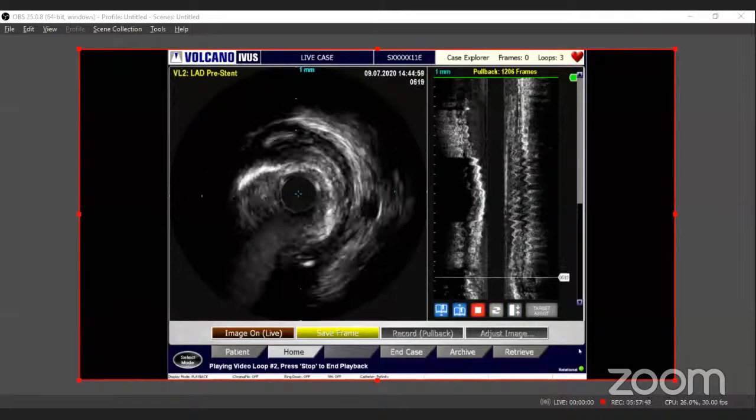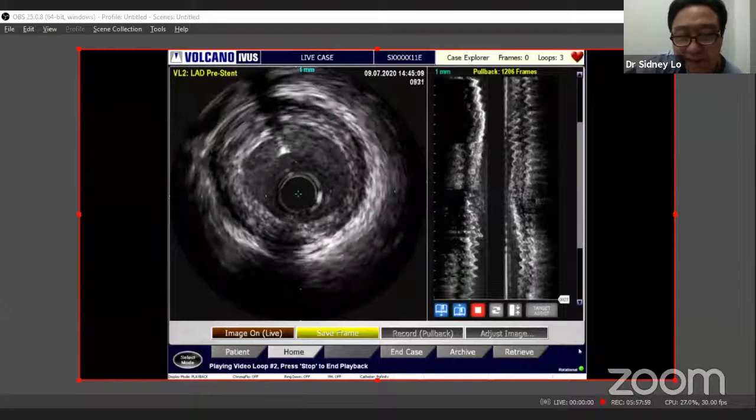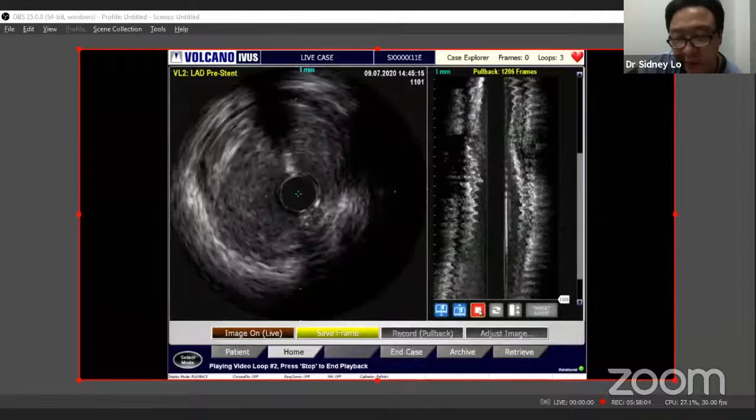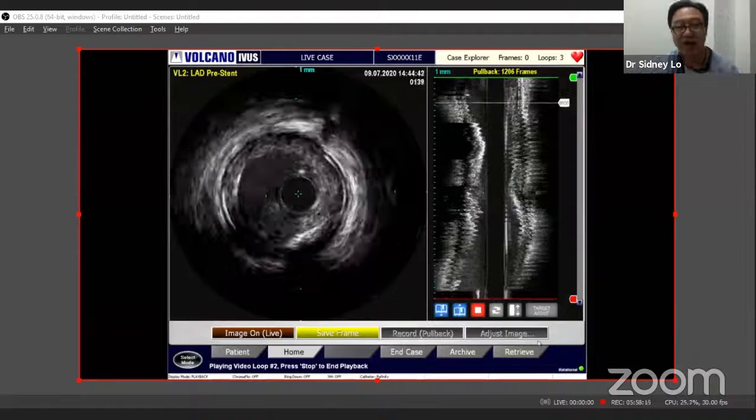Yeah. So once again, looking at the plaque distributions, a lot of plaque around, very concentric around here. And you can see that very commonly, the plaque is exactly what you expect in a bifurcation. It's straddled across the shoulders. Commonly, ostial LAD stenting is quite difficult to do because the plaque extends from the left main across. So commonly you see a lot of left main stenting in Korea. That's because so much imaging has been done. And we know that there is a lot of plaque that extends across that shoulder.